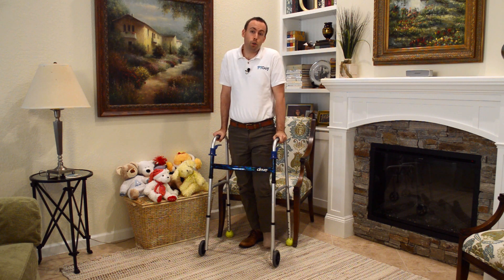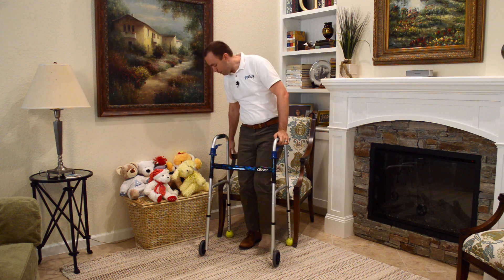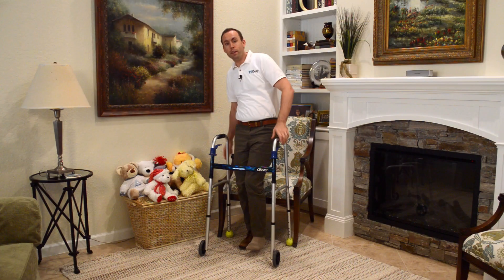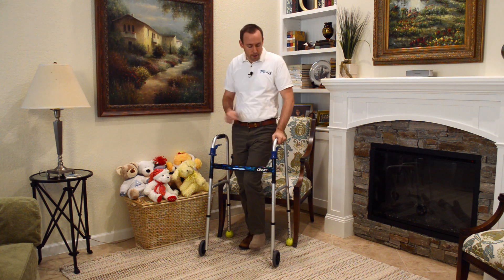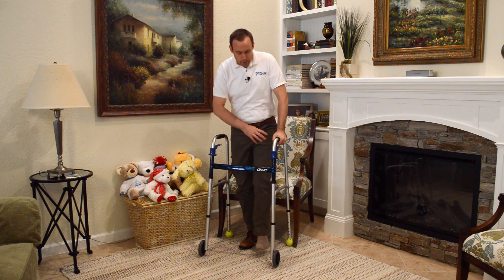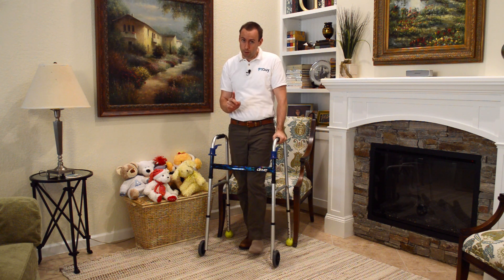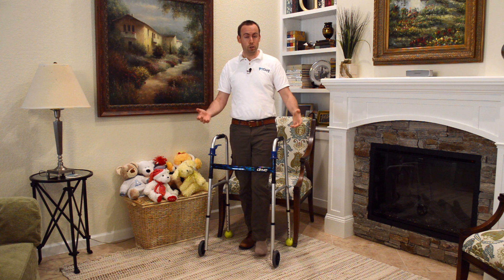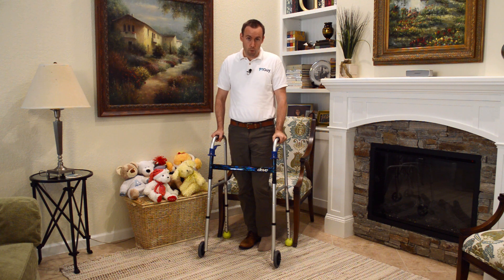Now you're stagger stepped — that's how the technique gets its name. I've got one hand down on the chair and one hand up on the walker, so there's never a zero point of contact. I leave the chair with my hand already up on the walker and I can get up fine. If I don't have a leg, this creates another leg — the stability. Do be careful not to push too hard on the walker when getting up, or it could tip over. This also works with a rollator walker, though a standard walker is more stable.